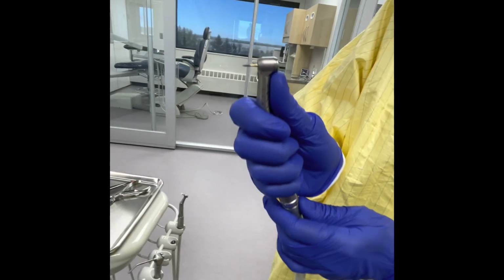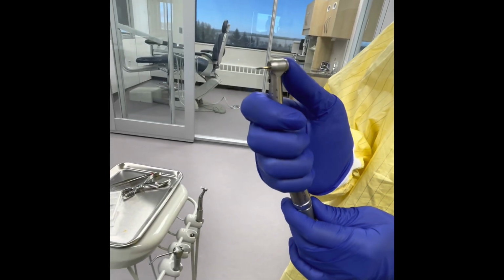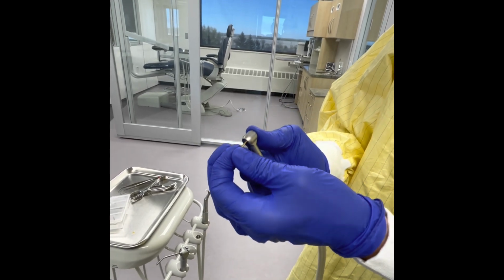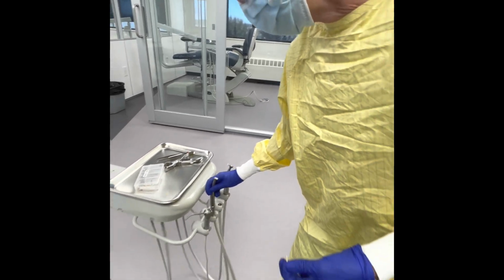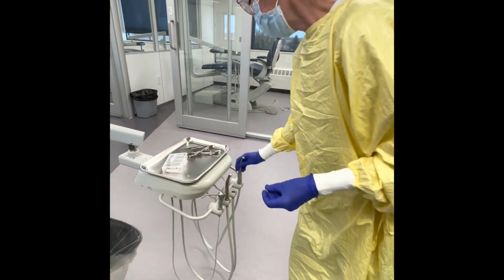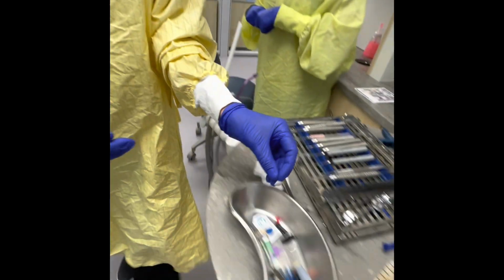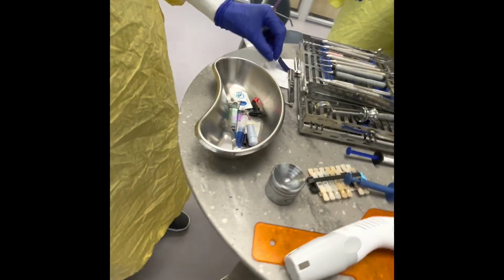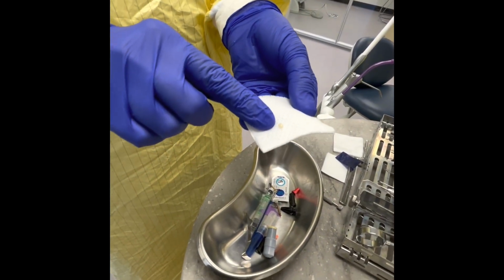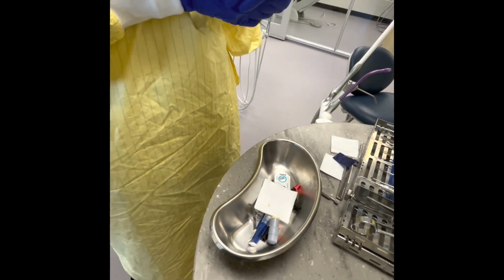So like I put these burrs in, I'm simply going to press on this button at the back, carefully grasp the burr and pull out, okay? Again with the slow speed, press that back button, pull out, and this will go in the kidney basin as well, okay? I have a little bit of composite on this gauze that when I tested it, it hasn't been cured, so it will go in here as well.